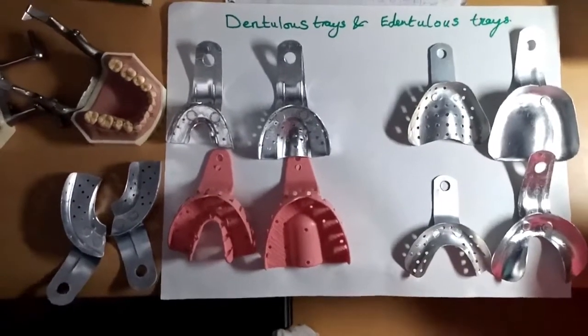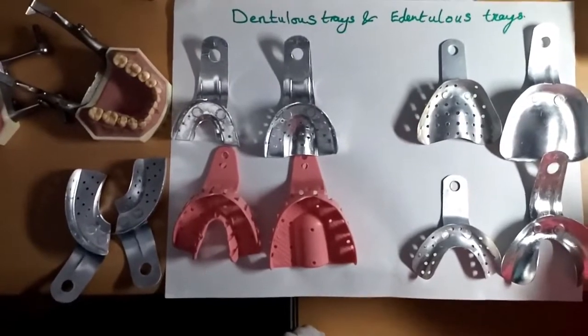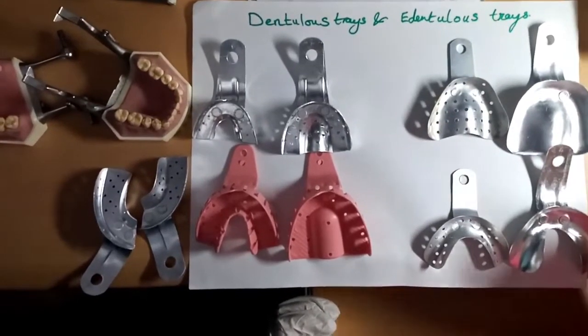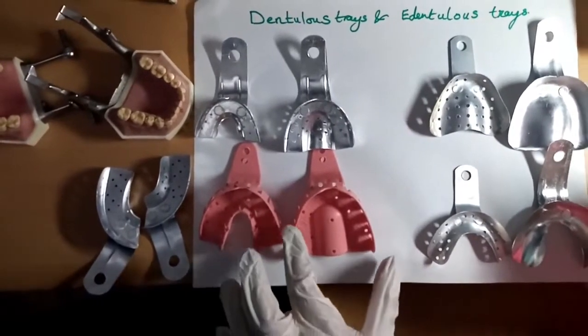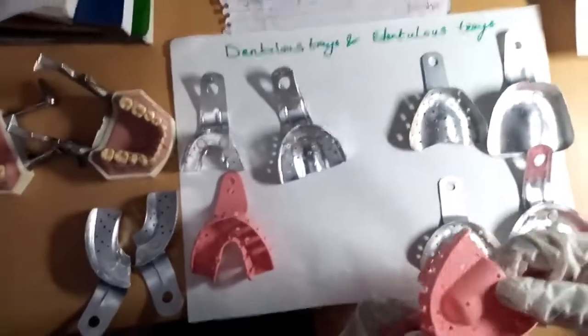Hello, today we're going to talk about the definition of impression trays, and then we're going to talk about the parts of impression trays, and finally we're going to talk about the classification of impression trays. Okay, let's start off with the definition of impression trays. They are used to carry impression materials while making an impression in the patient's mouth.